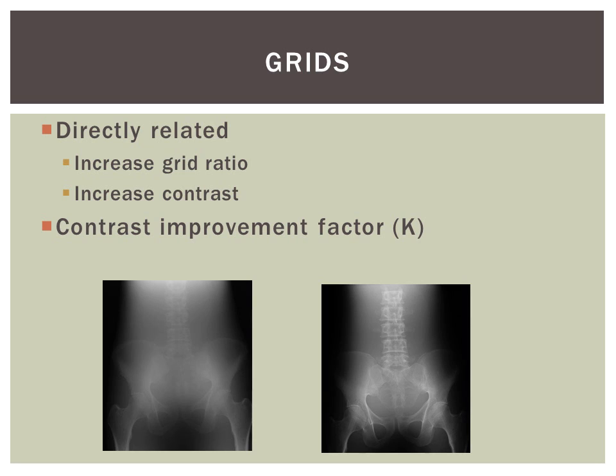Our contrast improvement factor, or K factor, is the best measure of how a grid accomplishes the removal of scatter, and is measured by our average gradient that we'll discuss in a second. It is controlled by scatter produced and tissue. So this is showing you two examples. The one to your left of your screen is at 80 kVp without a grid at 3.2 mAs. The one to your right is 80 kVp with a grid, and we increase to 17 mAs. Same AEC and overall density values.